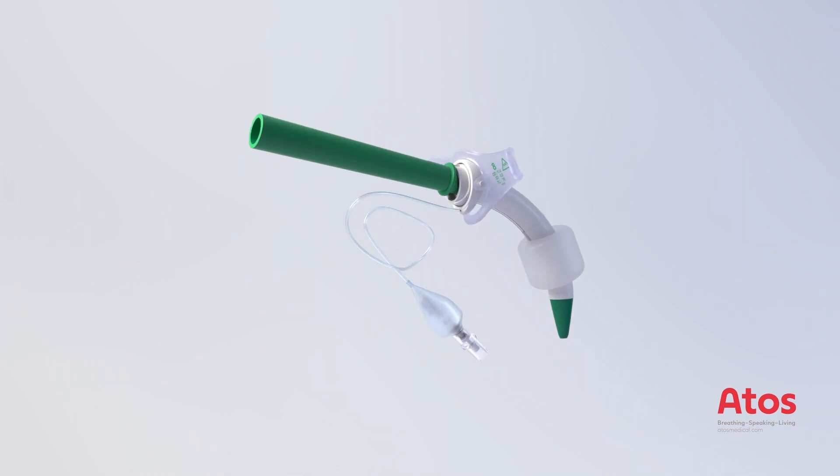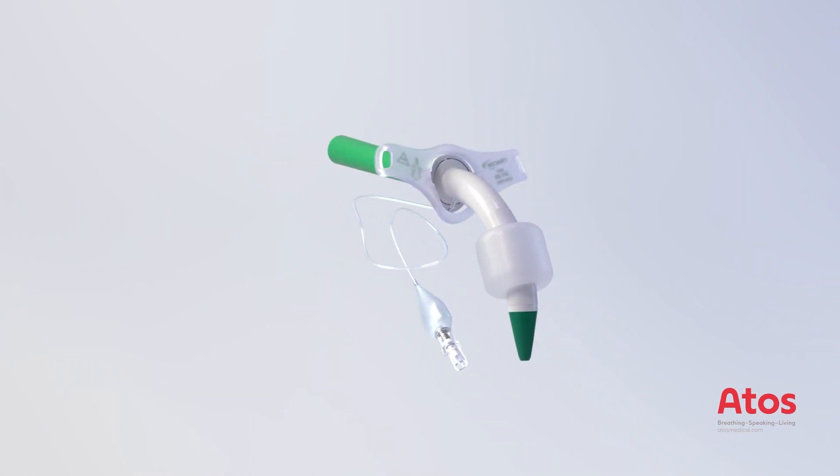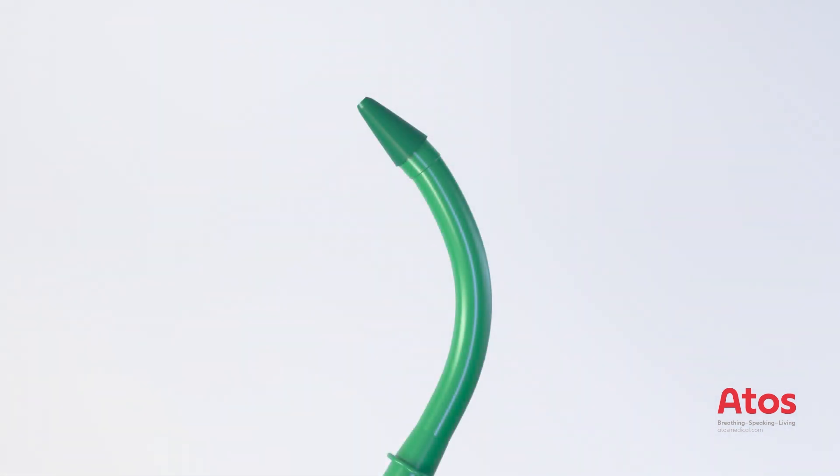The Traco Twist P-tubes are pre-mounted on a minimally traumatic inserter. For the placement of the tube, a silicone sleeve compensates the gap in diameter between the inserter and the tube tip. The sleeve is attached at the tip of the inserter.